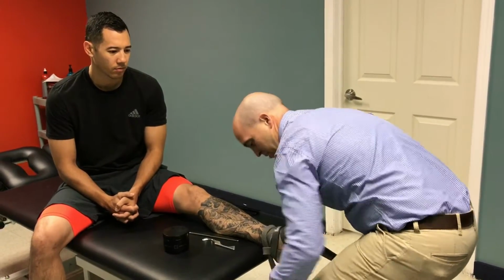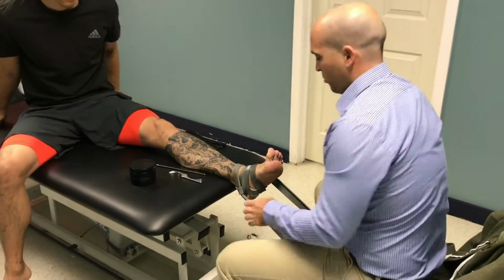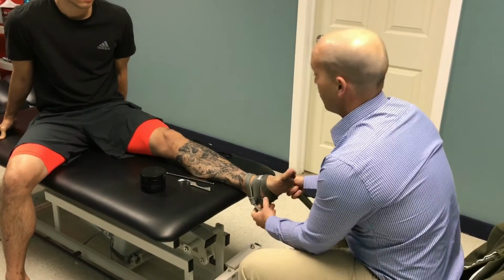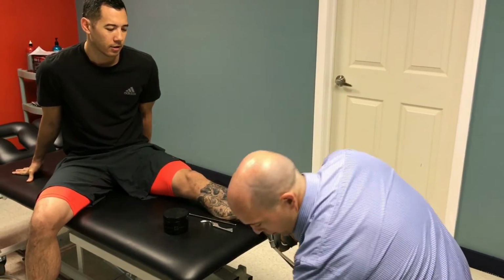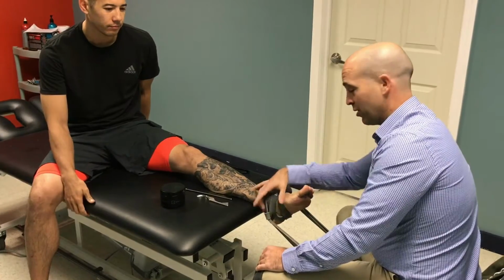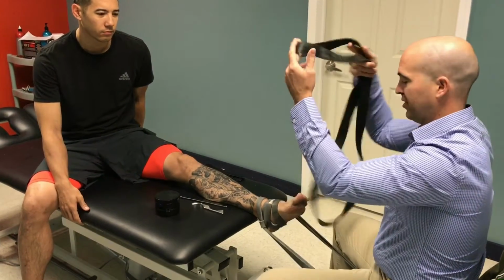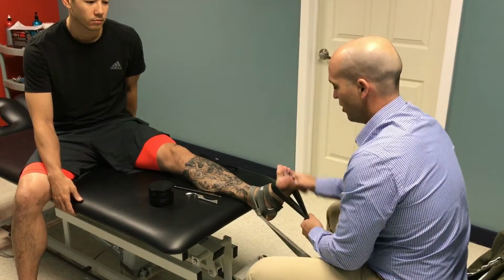Just put this behind me, under my thighs here. And you just want to pull back until Justin can feel it in there. Can you feel that in there? Oh, perfect. Too much? No. So what we're doing is providing some light distraction at the talocrural joint, as well as giving some compression with the bands, almost like voodoo bands. Then you give Justin some resistance to pull, and go ahead and pull straight up.